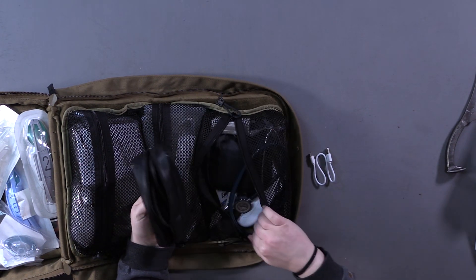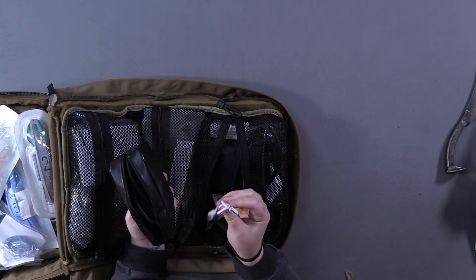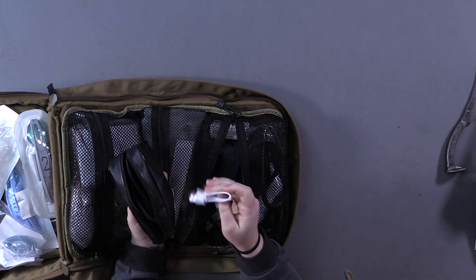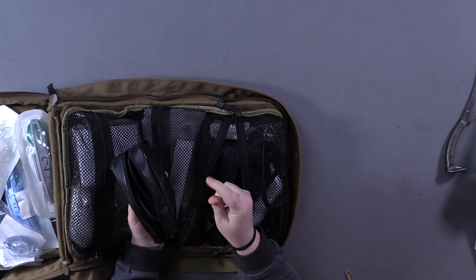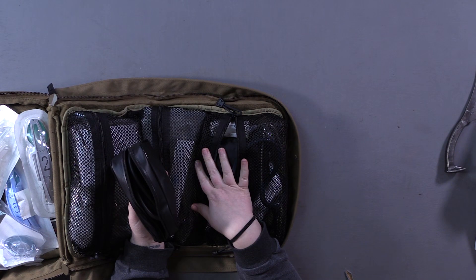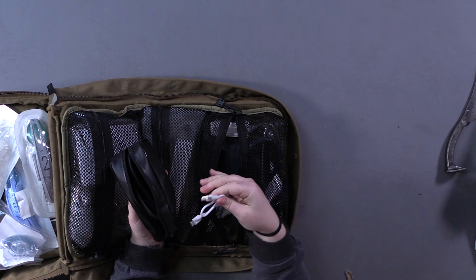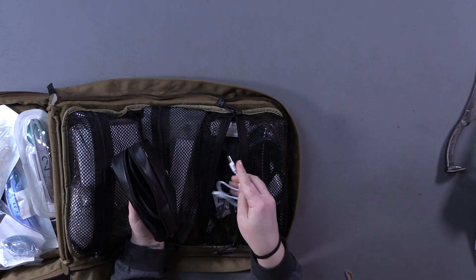We have a pediatric pulse ox — it's a little animal-style pediatric pulse ox. Here's the charger for it. We take them out at least once a month to charge them to make sure they work, and they go into any USB port or power outlet.